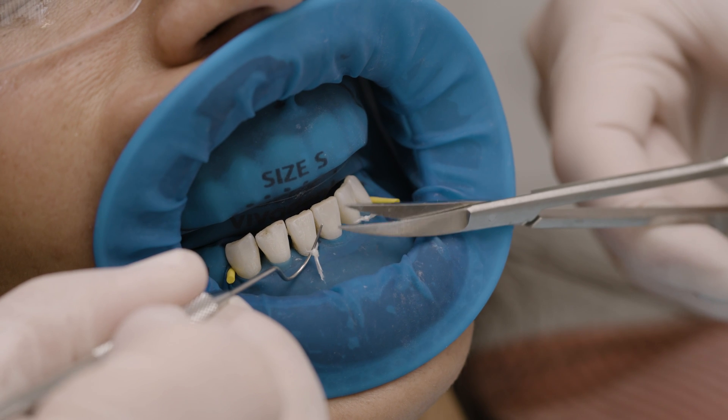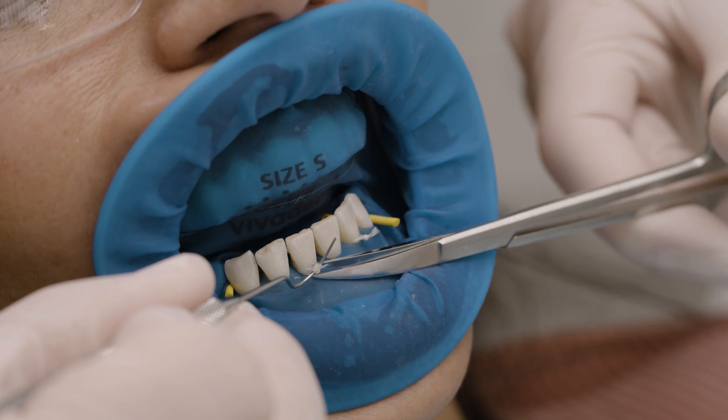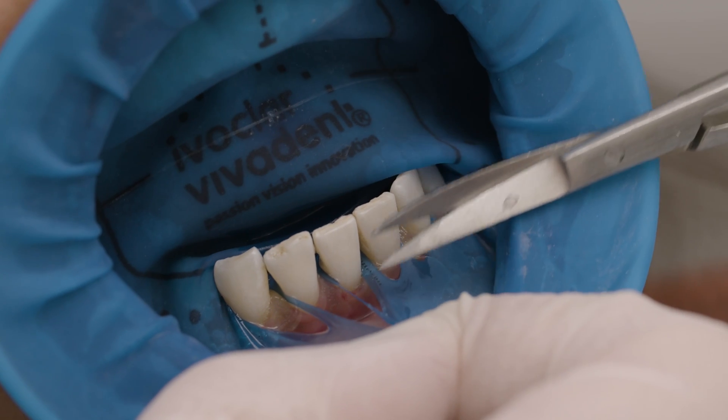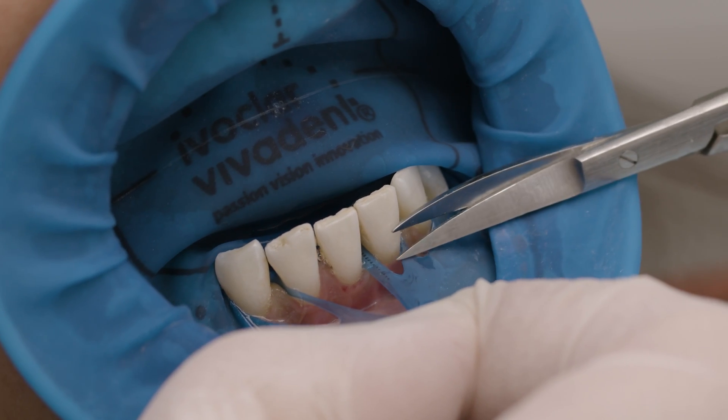After the treatment, the ligatures can easily be cut and removed. Then cut each septum carefully and remove the rubber dam.